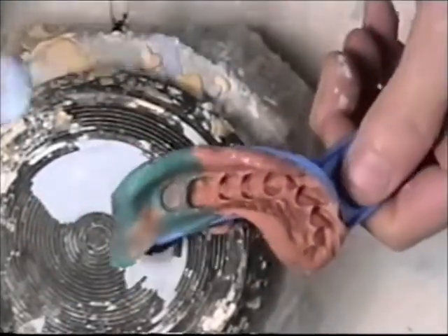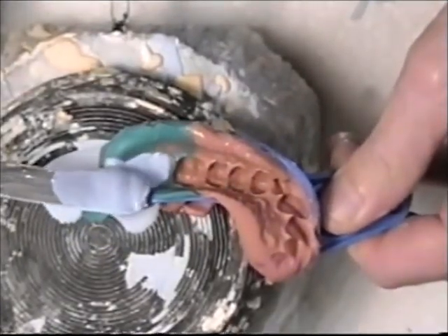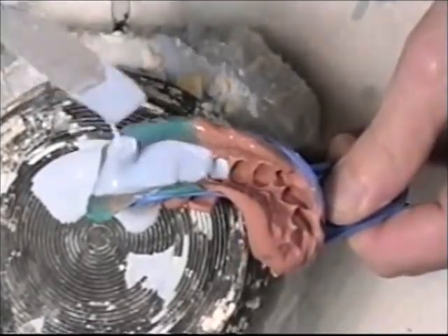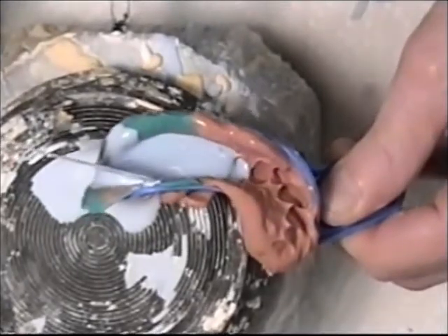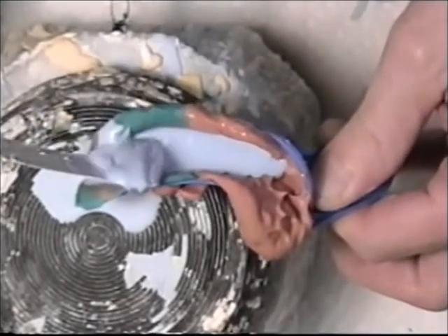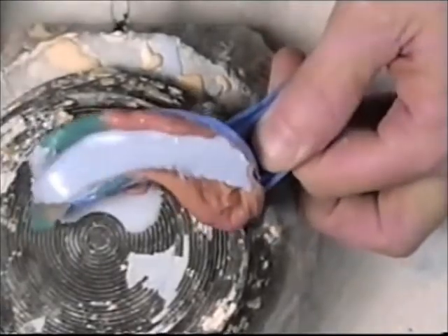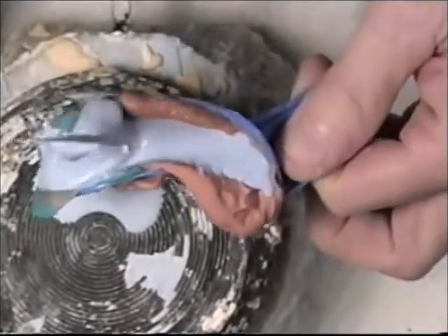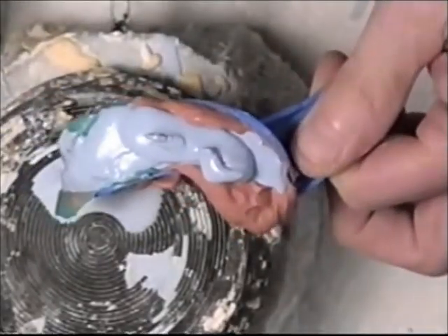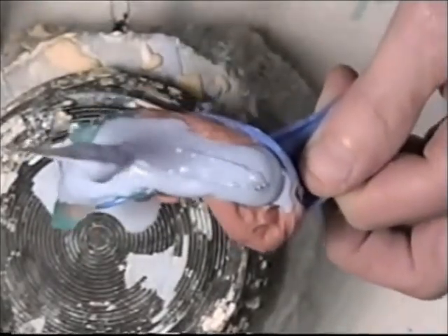Go to the next one, do the same thing. Start in the back and just carefully watch that it flows nice and easy — that's why we use the debubbulizer. It makes the impression material slick so there's no restriction. Now we can build it up here.